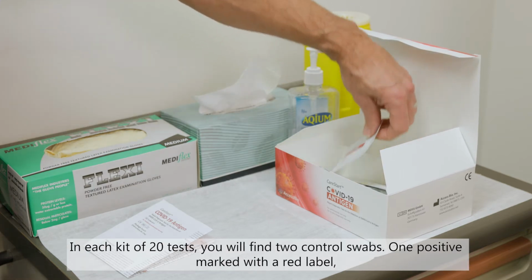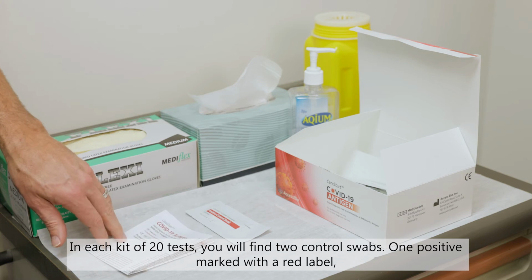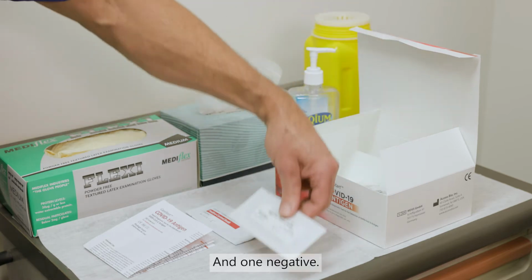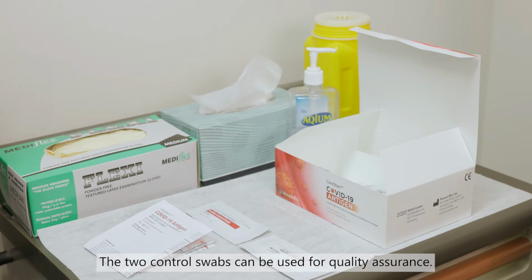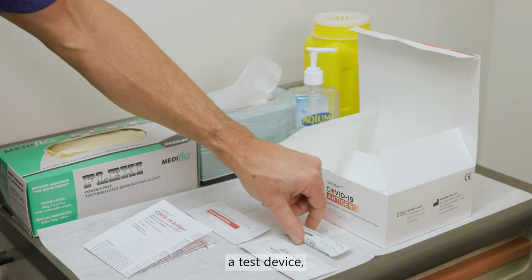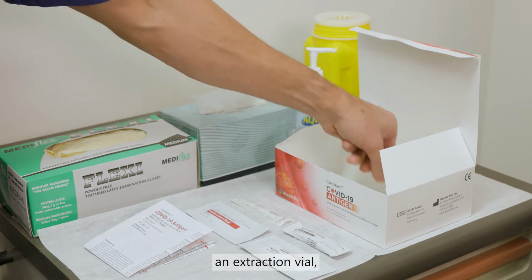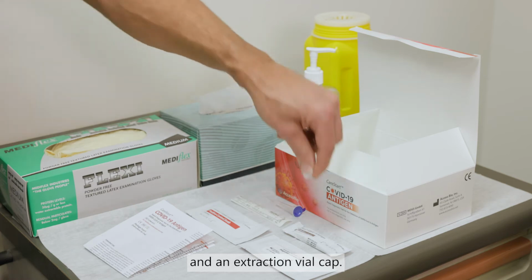In each kit of 20 tests, you will find 2 control swabs, one positive marked with a red label and one negative. The 2 control swabs can be used for quality assurance. For each individual test, you will need the following: a test device, a sterile anterior nasal swab, an extraction vial, and an extraction vial cap.